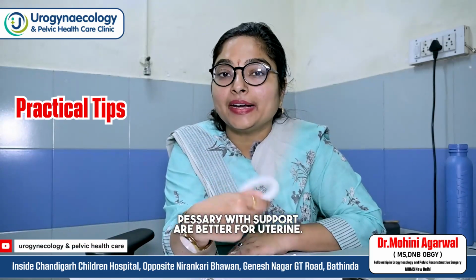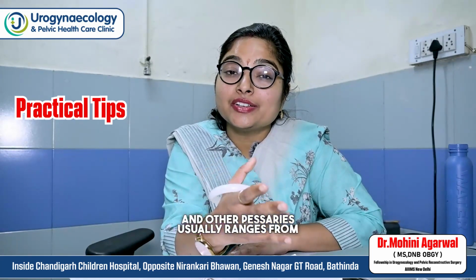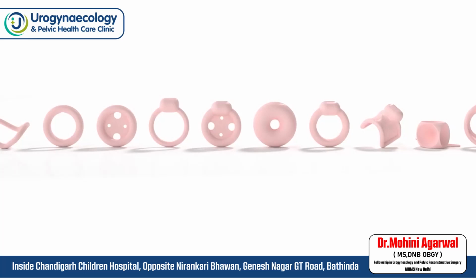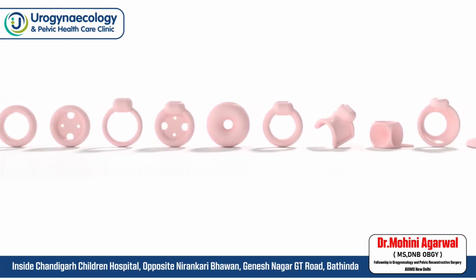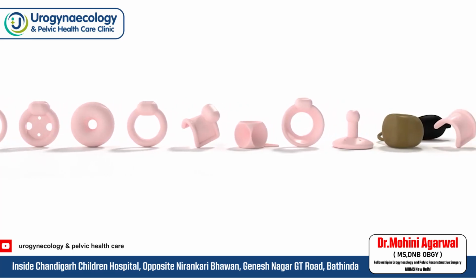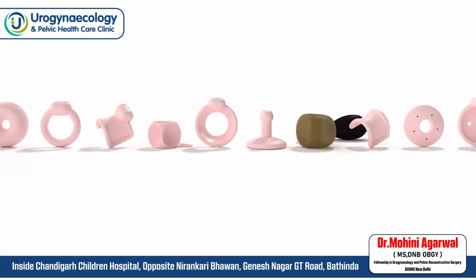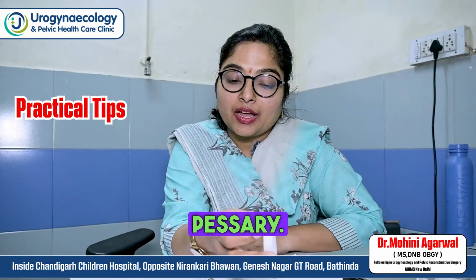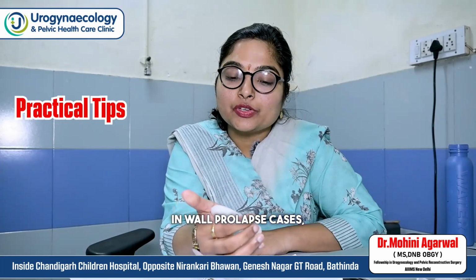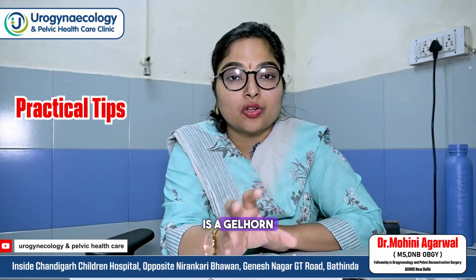Pessaries with support are better for uterine prolapse, but first you use the ring because it is cheap, and other pessaries usually range from 5 to 10,000. There are various criteria in pessaries: with support, without support, knob, Gellhorn, flexible stem, flexible, rigid, short stem, long stem. So first you obviously offer the ring pessary. In wall prolapse cases, your option of choice, clinically and practically, is a Gellhorn pessary.